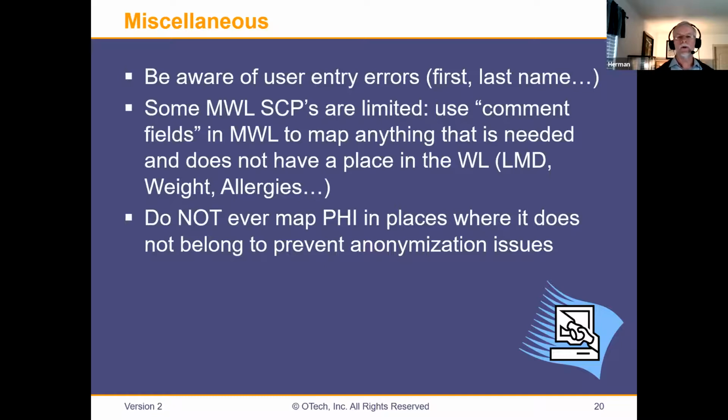And that's actually one of the relatively common frustrations when I talk with some of my students that are PACS administrators. They ask me the question of, what can I do? Because these are the people that clean up the mess, so to speak. So what can I do about the front desk being lousy and not being accurate enough, and sometimes putting the name in the wrong field? What can I do about it? I said, I don't know what you can do about it. You have to talk with your supervisor. So anything that depends on user entry could potentially have errors and problems. And last name, first name is one of the common ones.